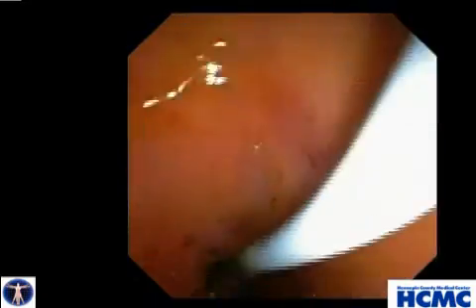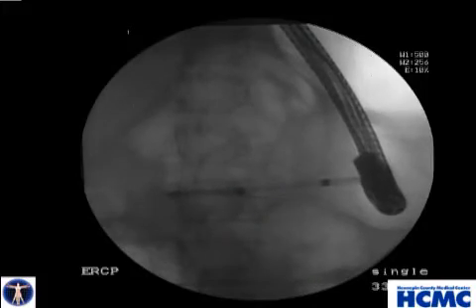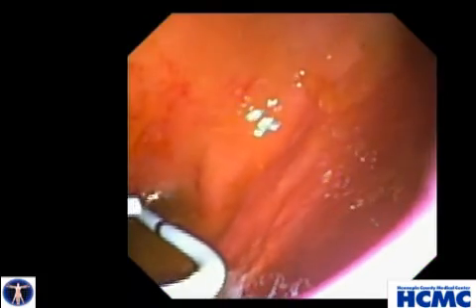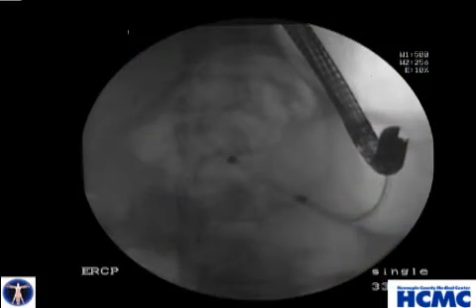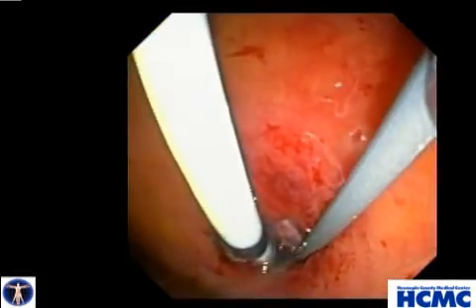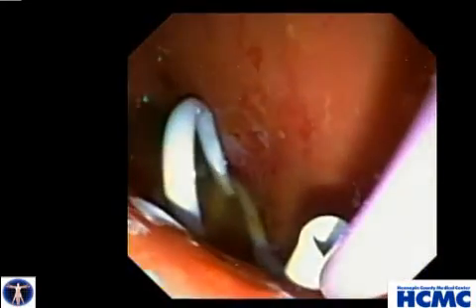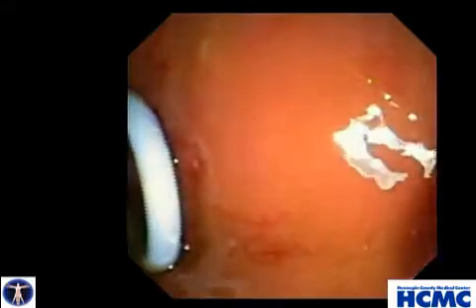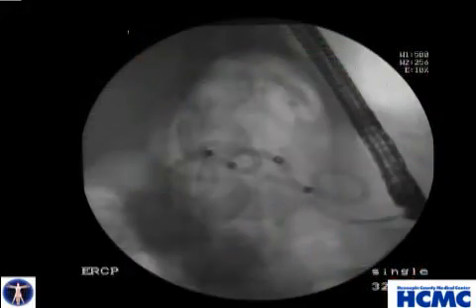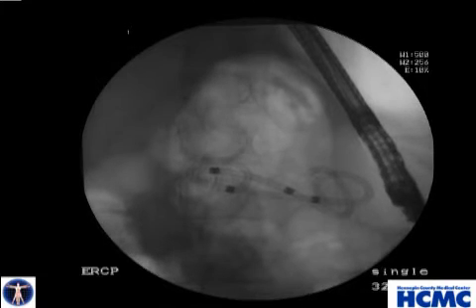We're now passing the Oasis type introducer catheter and placing a 10 French 3 centimeter Solus double pigtail biliary type stent in the pseudocyst cavity, now again fluoroscopically. We prefer these soft type of stents over hard traditional polyethylene stents because of less concern of erosion into the back wall of the cyst. Here is the second stent going in, and we always place 2 stents to keep the tract open.